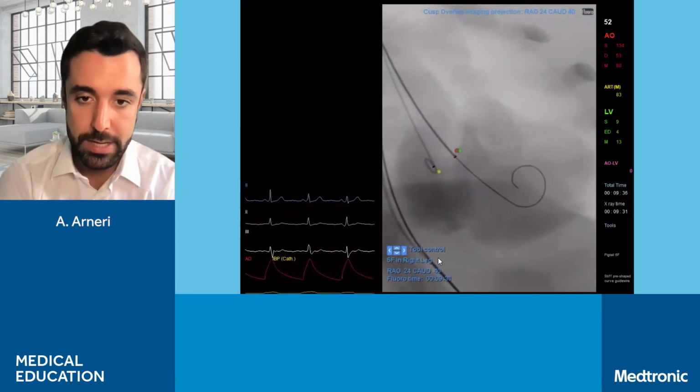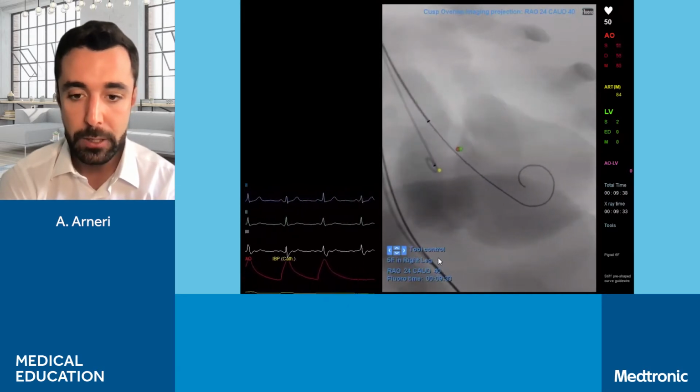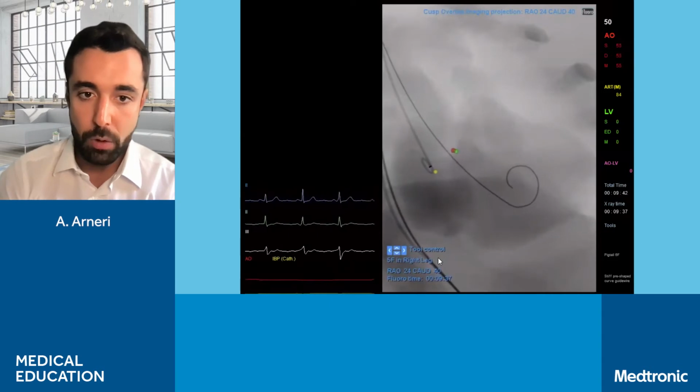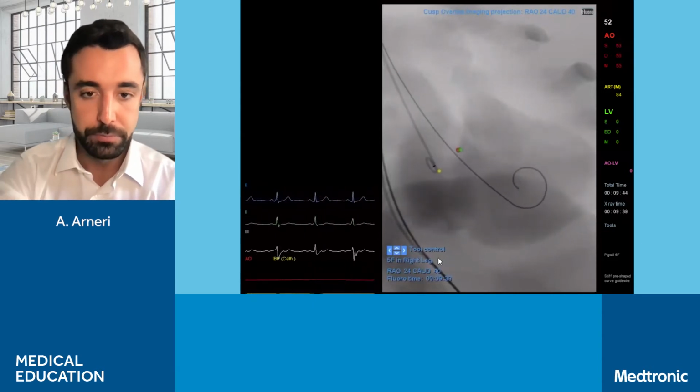So now we see nicely the pre-shaped tip of the wire into the ventricle, and we are now removing the pigtail.